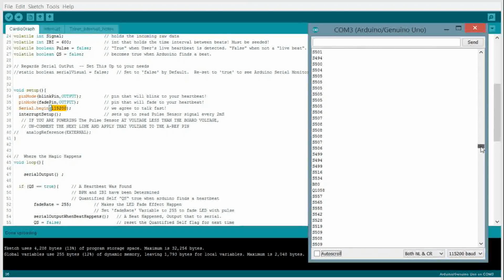See, this is more correct, 1058. So that other one, 3, that's pretty low. It's probably a bad reading. This is probably a correct reading, 80 beats per minute. Again, this is the 10-beat average. This does not reflect this. This is beat by beat. So this is really more around 60 beats per minute, and this just hasn't dropped down to it yet.